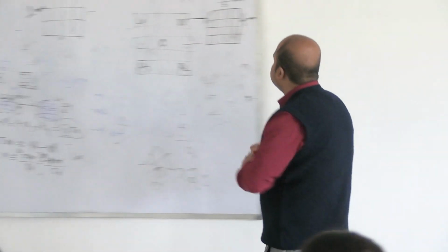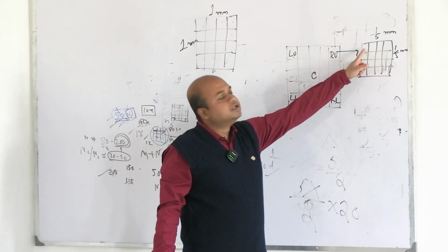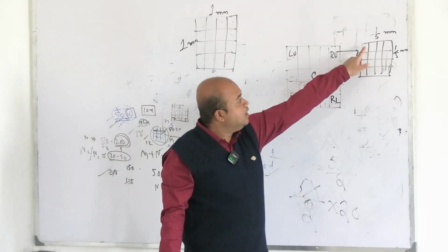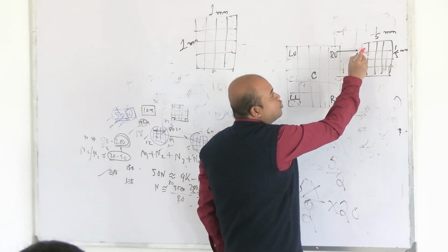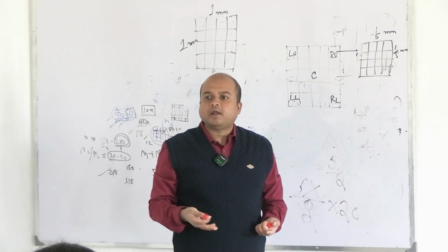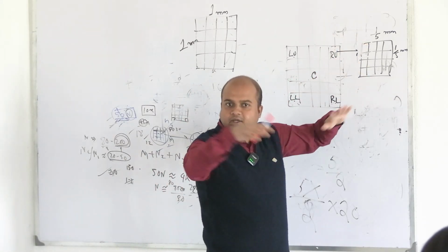There is a rule of counting that is called the L rule. L rule means, when you are counting, say out of the 16, the first one, conventionally we count from the left upper side, the left uppermost of the left upper square. So we start with that, and when we consider this cell, if we try to count, cells are uniformly dispersed, cells will remain on these margins also. As there are lines, there will be cells over the lines, but there are so many cells.